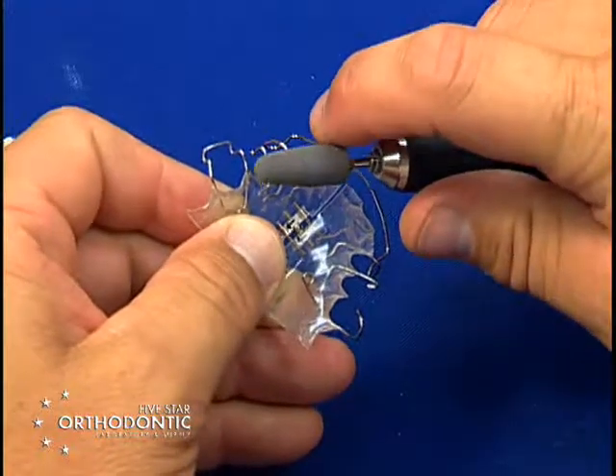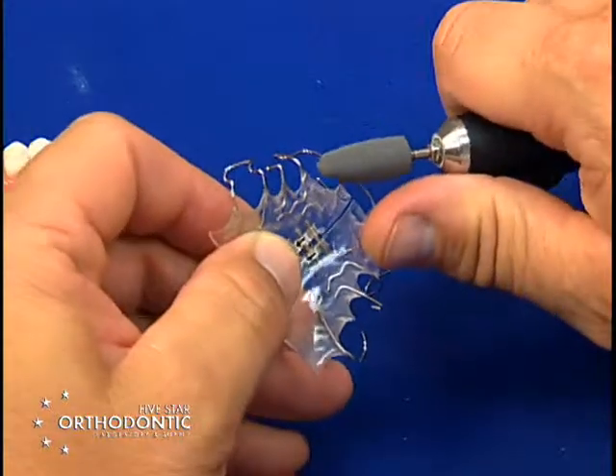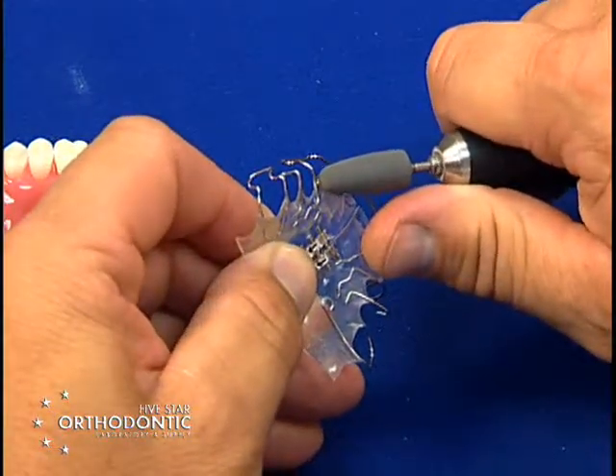Now this burr is friendly to metal, so you won't have to worry about nicking your metal, so make sure you do have a metal friendly acrylic polishing burr.